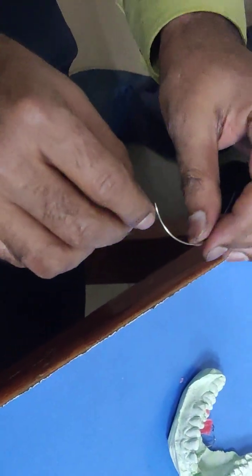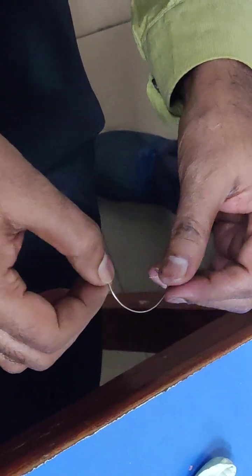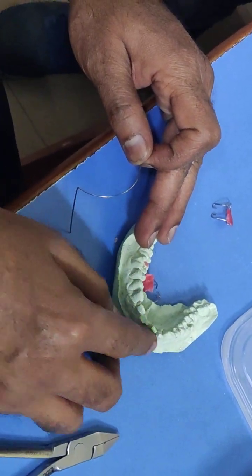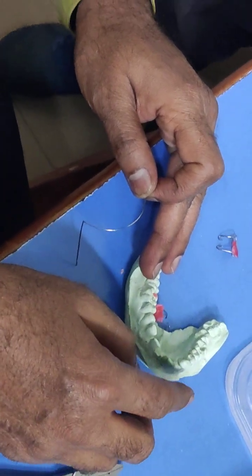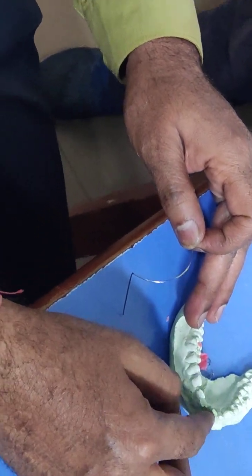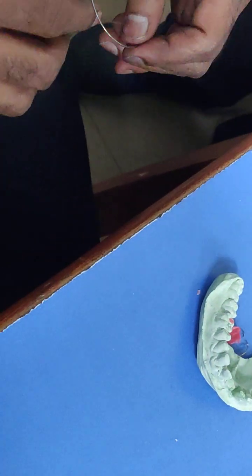Remember this: before giving the first vertical bend, you place the curved arch along the middle portion of the incisors, neither incisally nor gingivally, but better in the middle third region.